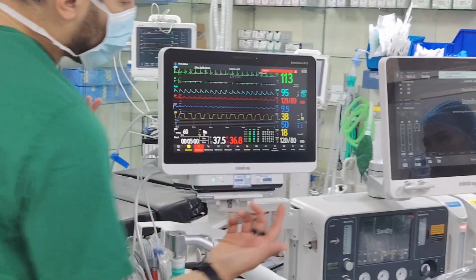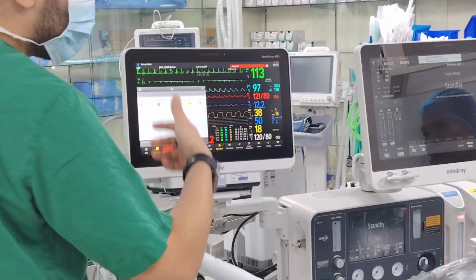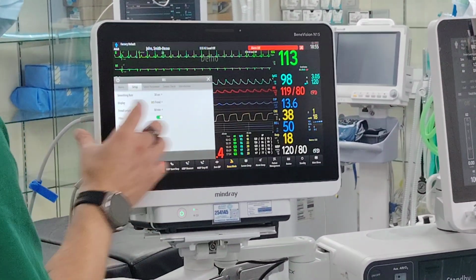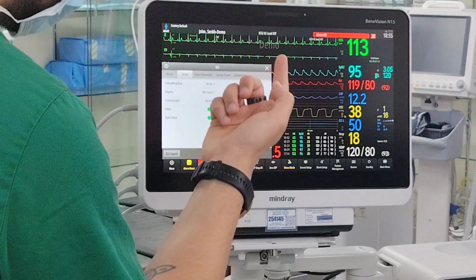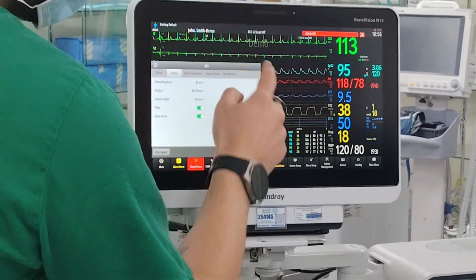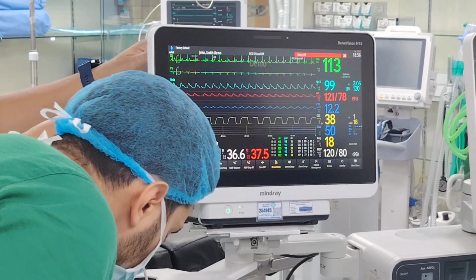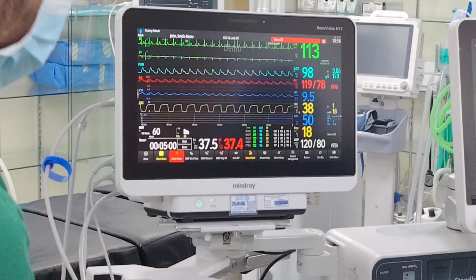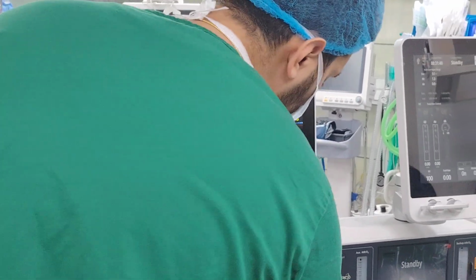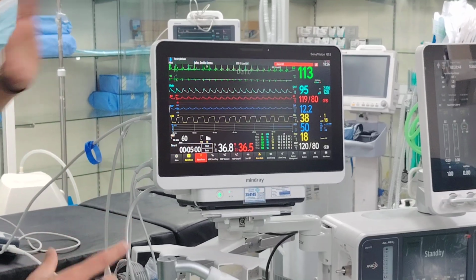Okay? Now, most doctors I've seen, they like to see the EEG. But anyways, you have all the options later on. You explore and see what you would like. Any questions you can tell me later. You can ask. Okay, this is for the BIS, and then the consumable is very straightforward. This is the connector over there, and then you have a clip here. Usually, they like to put the clip there. Okay, in that sense. Now, a few extra things before I go to invasive.